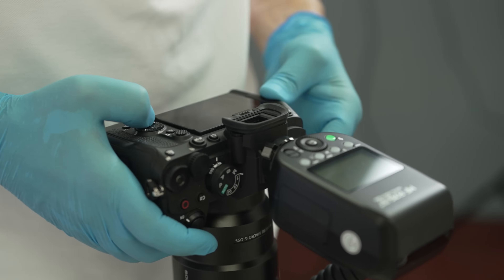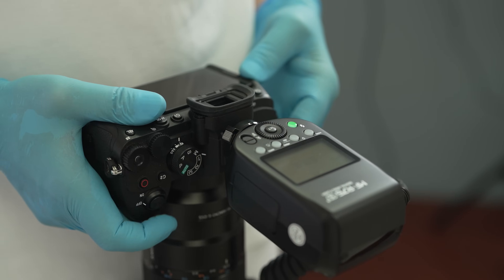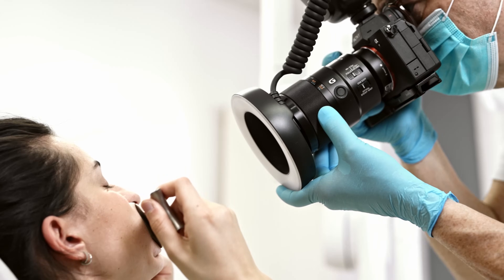By using these kits, dental professionals can improve their image quality. The camera is easy to set up, the flash is easy to set up. This is a great combination for consistent results every day — reduced image post-processing, and you get your shot right the first time.